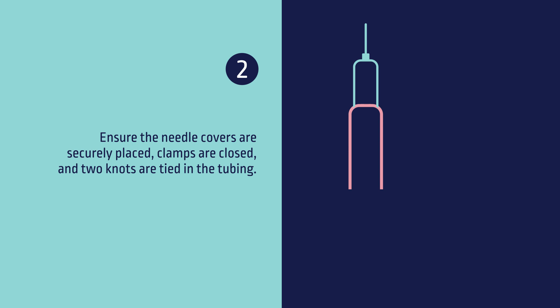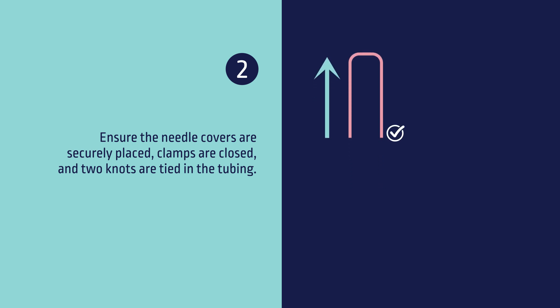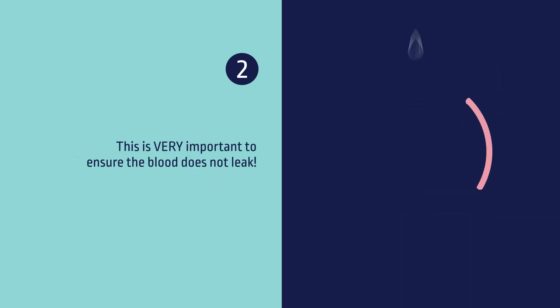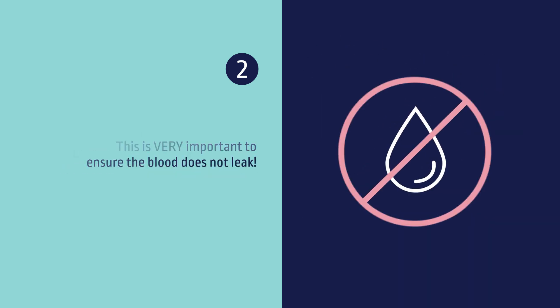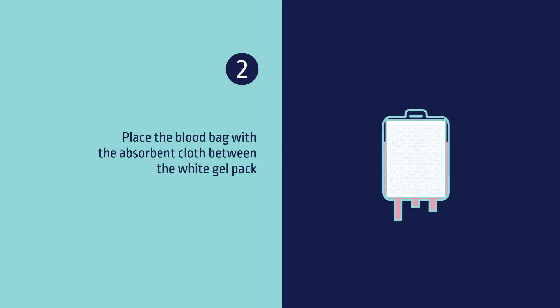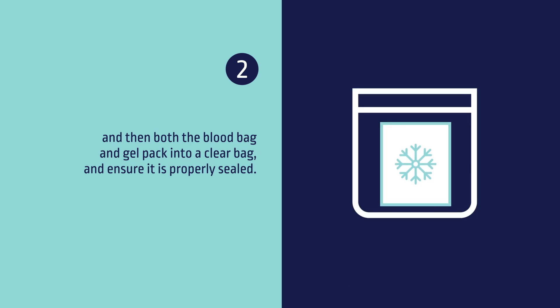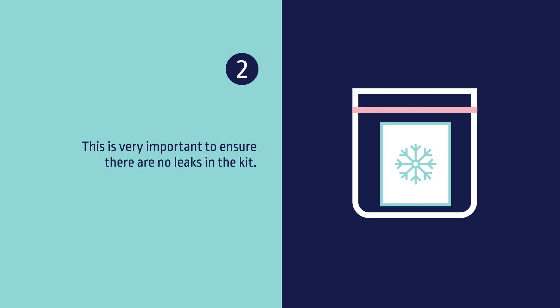Two, ensure the needle covers are securely placed. Clamps are closed and two knots are tied in the tubing. This is very important to ensure the blood does not leak. Place the blood bag with the absorbent cloth between the white gel pack, then place both the blood bag and gel pack into a clear bag and ensure it is properly sealed. This is very important to ensure that there are no leaks in the kit.